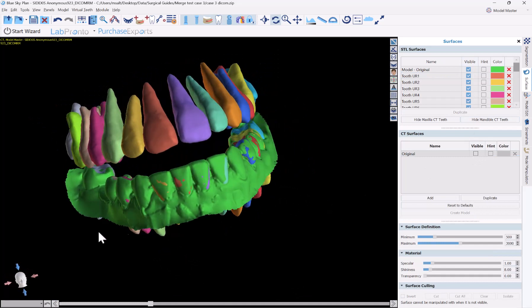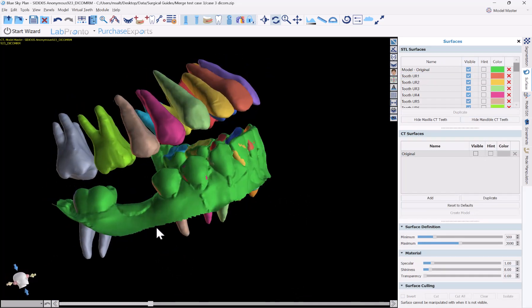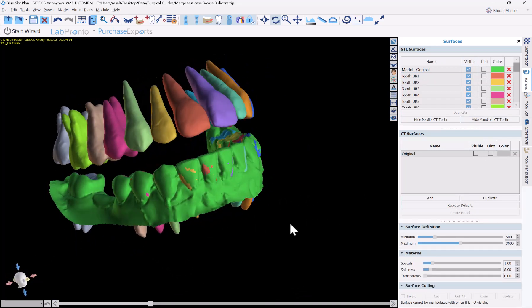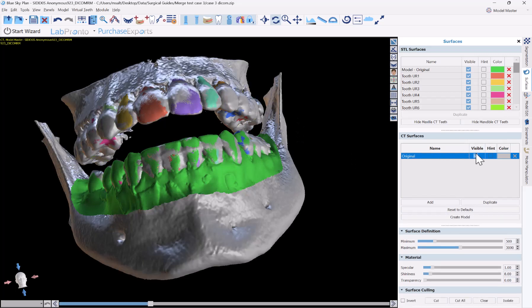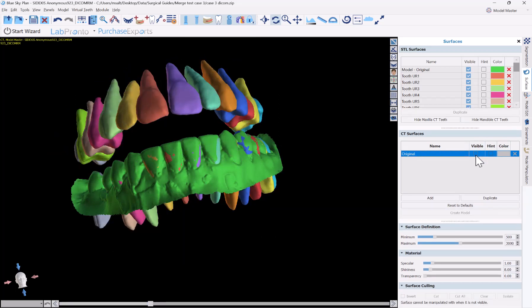This functionality is free and will continue to be free in the Blue Sky Plan software. So now I have my original model that I've imported, I have my CT teeth segmented, and I have my original CT scan.